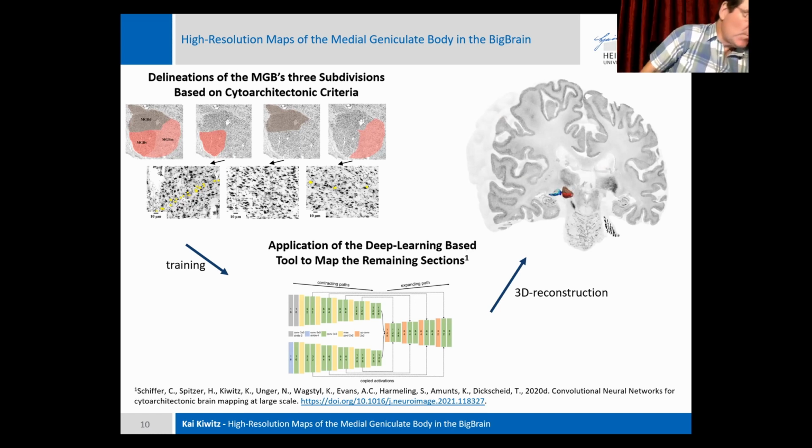I think, Timo can answer this more directly, but pretty much 75% of the data is being collected at 1 micron. Timo? Yeah, there are sections available, and there are sections scanned at 1 micron, and we have plans also to release them, but they are not all of the same quality. And we don't have them all, but a large fraction. And I will come to this a little bit in my talk later today. But there's 1 micron data available.